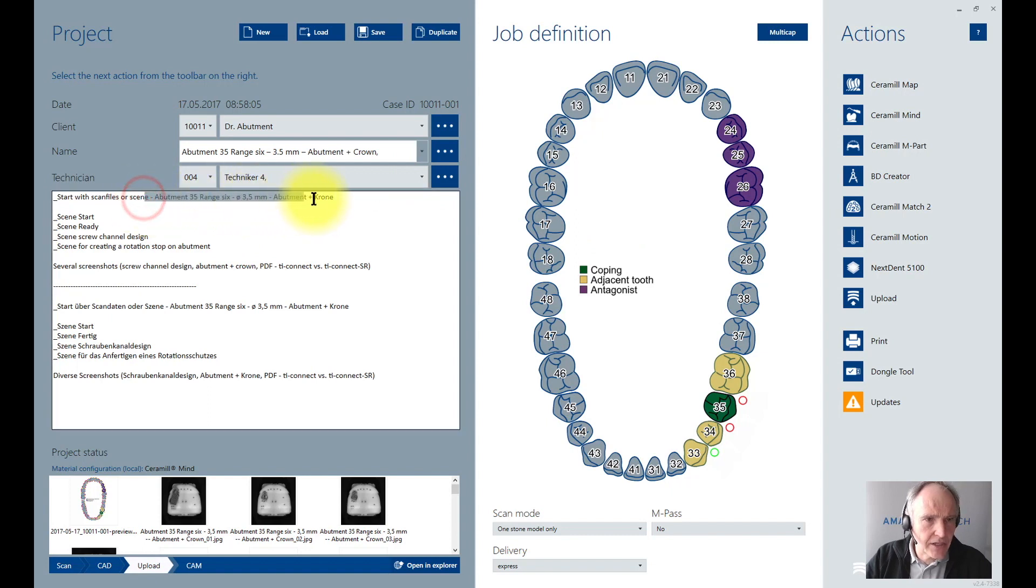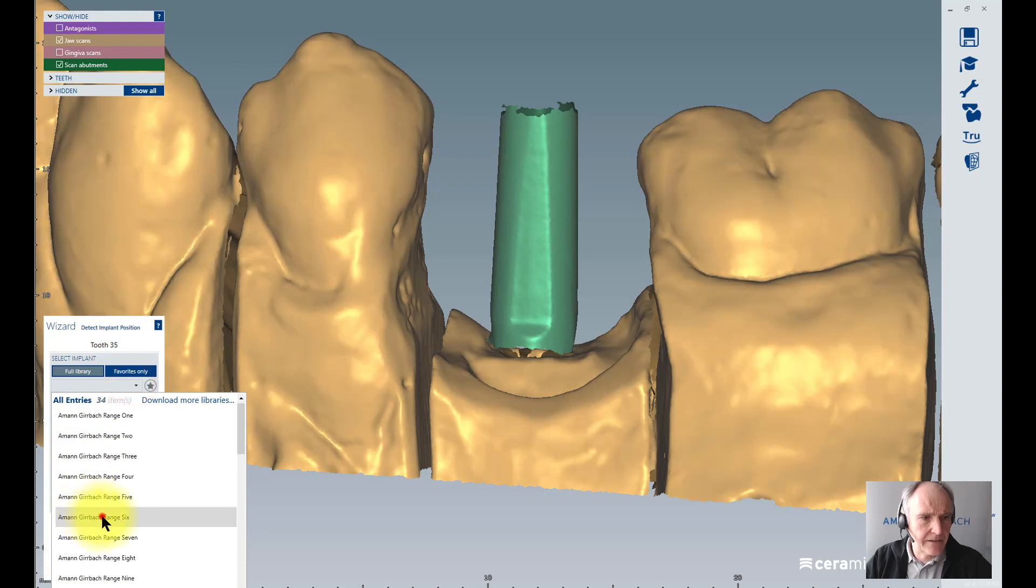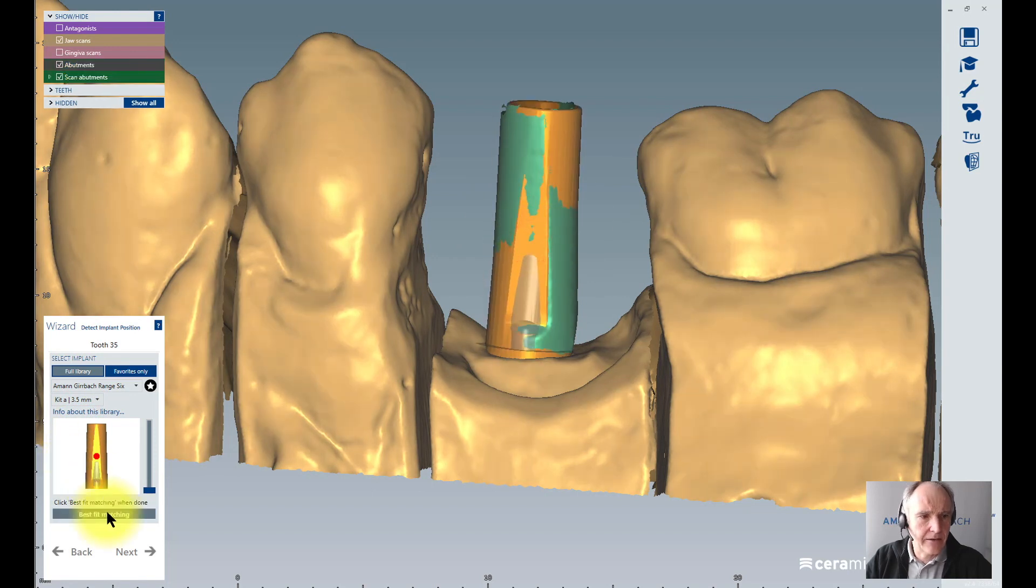After creating my patient's card, I always write down which abutment system I use in the text box. Then I go directly to the construction. In the constructions I load my system of abutment - here it's a range 6 for example and a 3.5 millimeter diameter. Then I click on my scan body and click on best fit matching and continue.